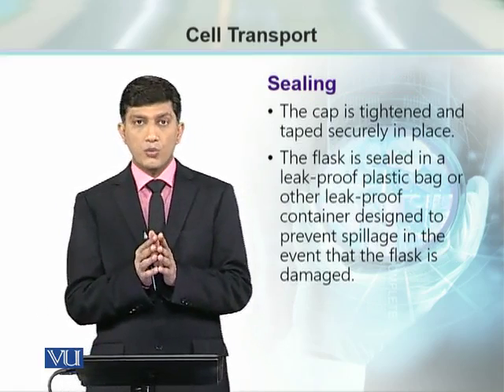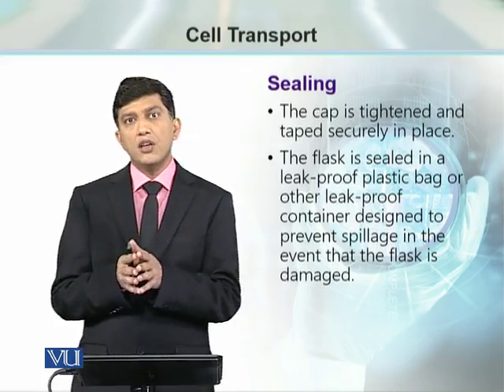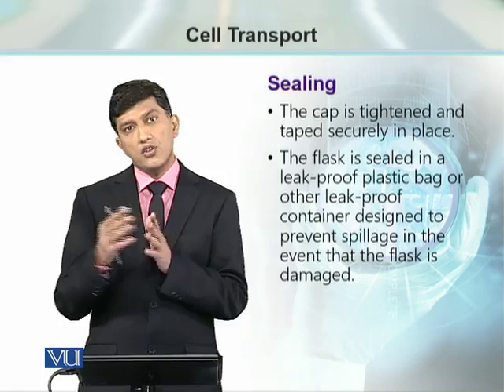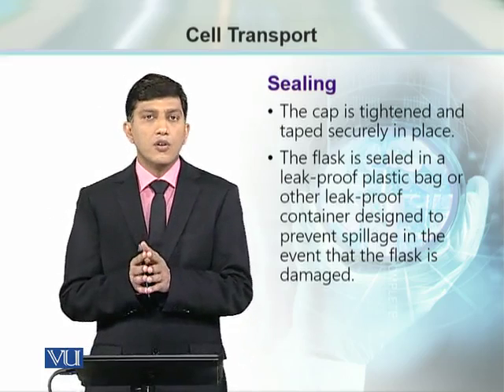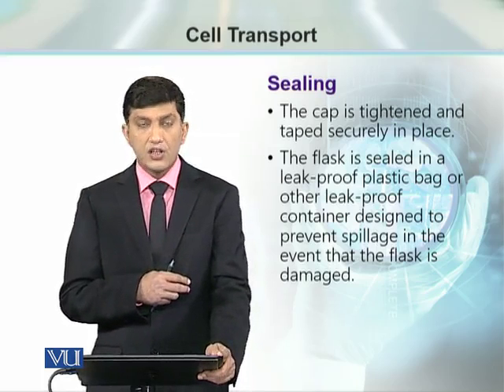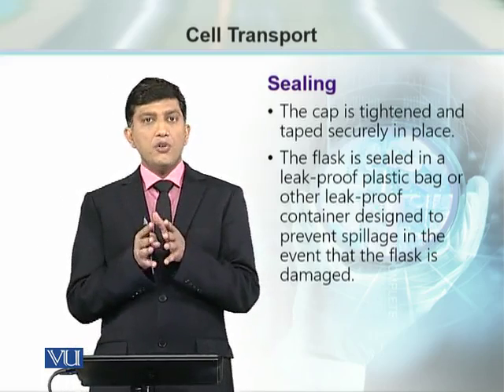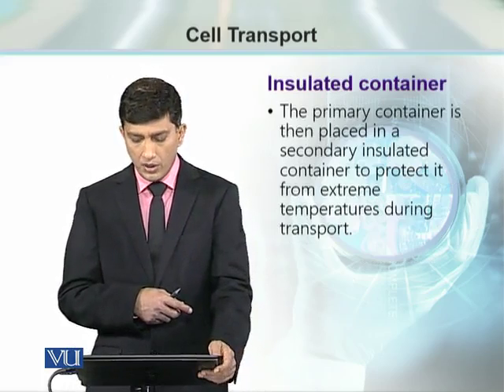Then, to ensure that there is no leakage during the transportation, there is no loss of culture media, we are going to properly seal the flasks, but keep in mind flask should be sealed, but the ventilation के लिए जो कैप में कुछ फिल्टर पेपर लगे होते हैं they should not be sealed, otherwise suffocation जो है वो डेवलप हो सकती है फ्लास्क में. फ्लास्क को सील करने के बाद एक लीक प्रूफ प्लास्टिक बैग में सील किया जाता है या फिर किसी दूसरे कंटेनर में, ताकि ड्यूरिंग ट्रांसपोर्टेशन अगर ब्रेकेज या डैमेज हो गया फ्लास्क को तो जो हमारे लाइफ सेल्स हैं दे शुड नॉट बी स्प्रेड इन द environment.